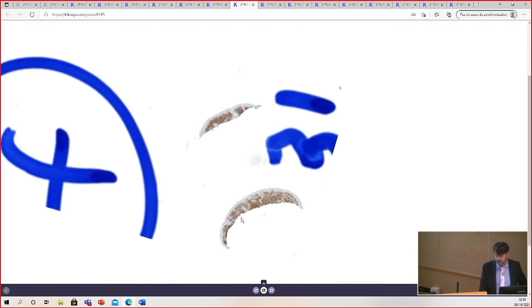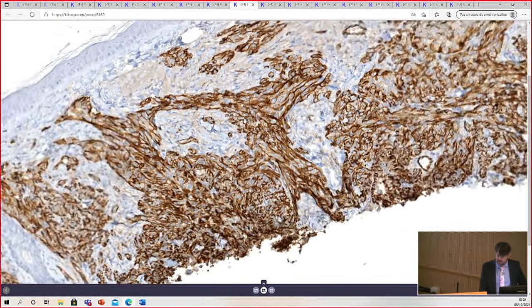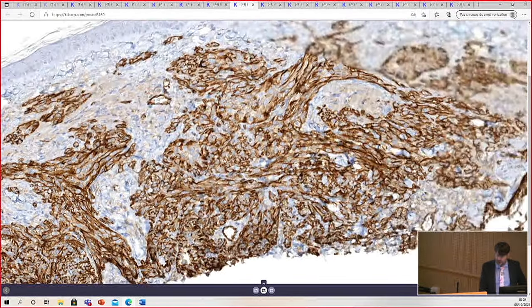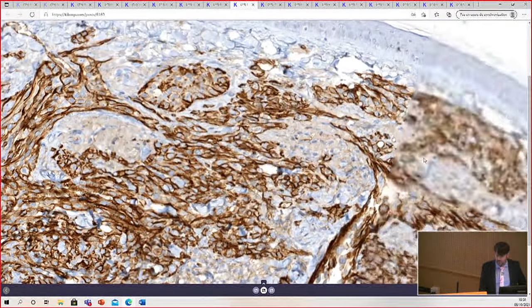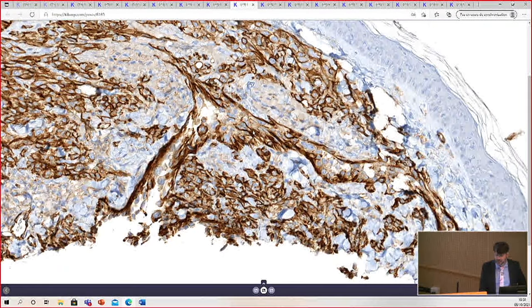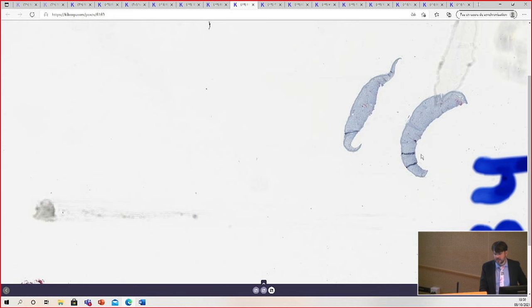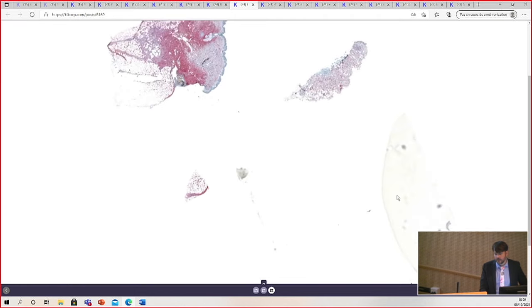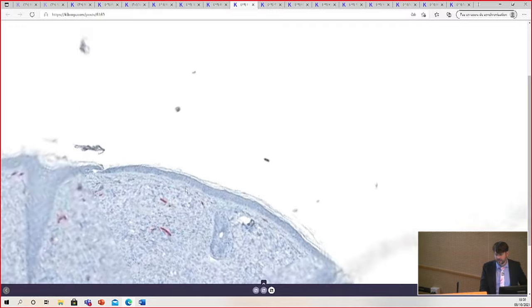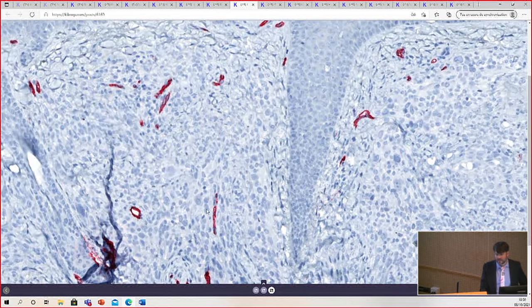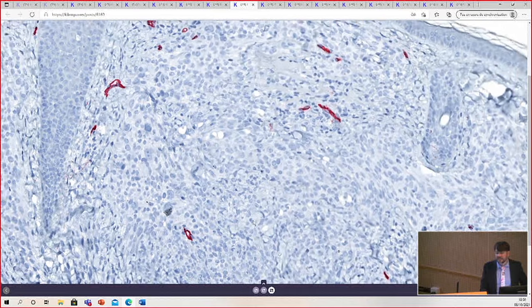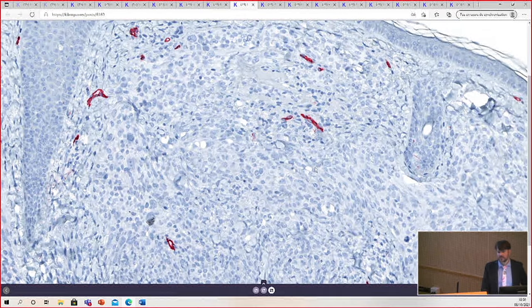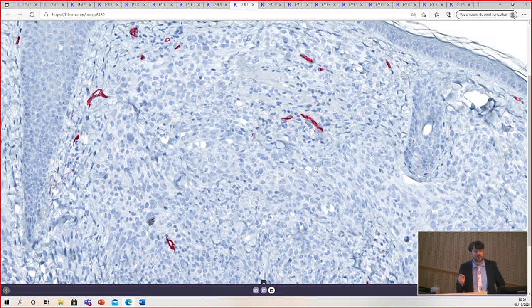Here is CD31, blazing, very, very positive. And here you can see vessels lined by atypical CD31-positive cells. And now CD34, staining only the background vessels, completely negative in the tumor cells. This is one of several cases I've seen of CD34-negative angiosarcoma.